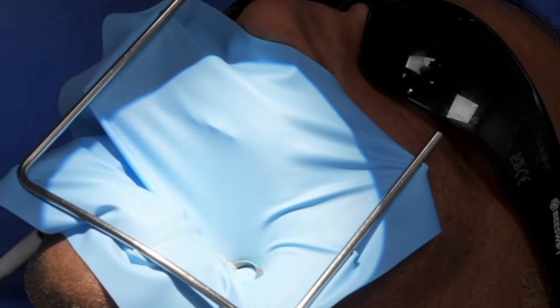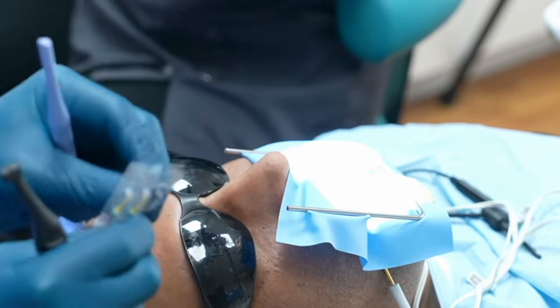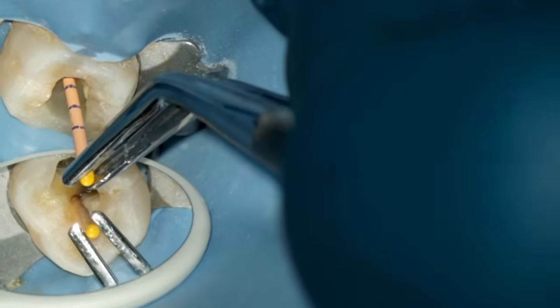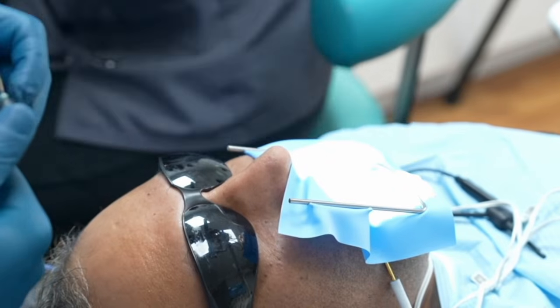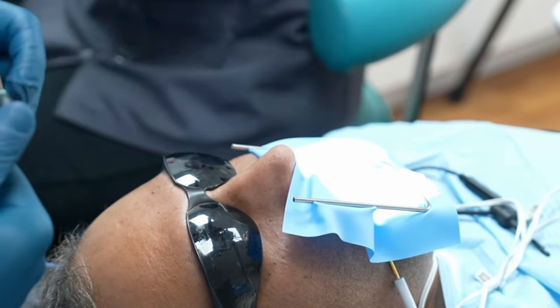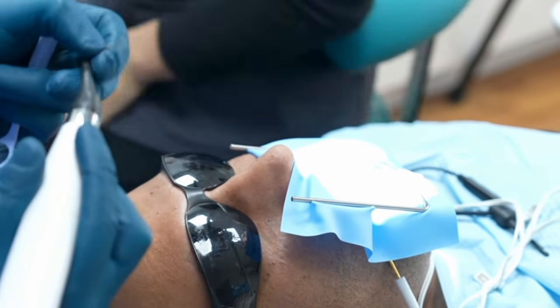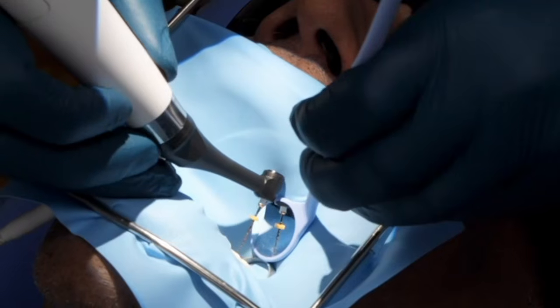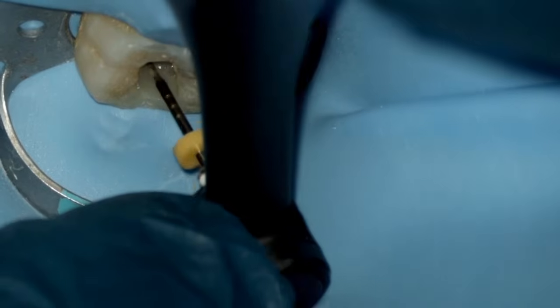When it came to obturation, after our final irrigation protocol, my irrigation protocol is fairly simple. I use sodium hypochlorite throughout the whole process, a penultimate rinse with EDTA for 1 to 2 minutes each canal, and then the EDTA gets activated with a sonic activation device such as the EndoActivator, and then hypo as a final rinse with some activation. Canals were dried, there was no pus or bleeding, so I was happy to obturate the canals.